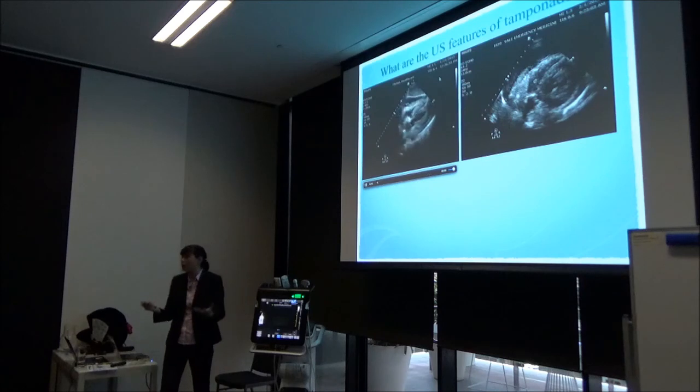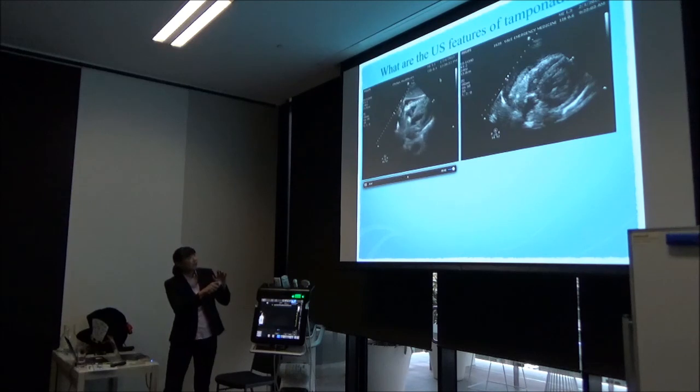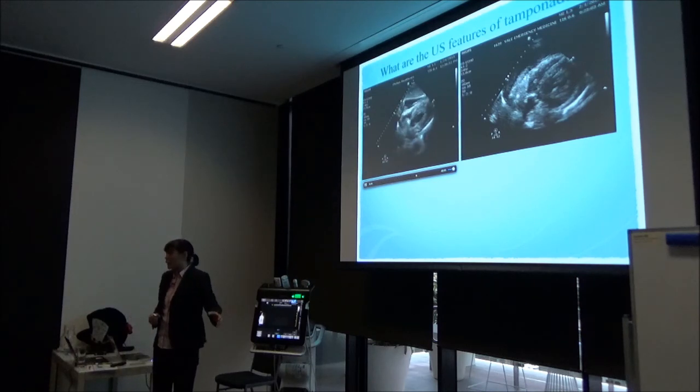This can be hard to tell. We can show you how MO can help you. But just a reminder that for tamponade and pericardial effusions, it can actually happen with very little fluid. So just because this doesn't look like that much fluid doesn't mean that there's not tamponade. Anyone understand all my double negatives there?